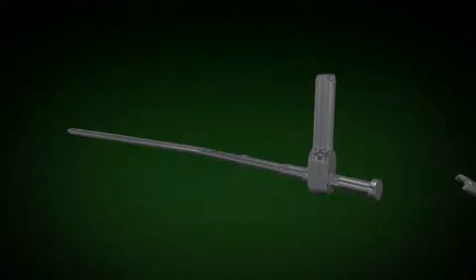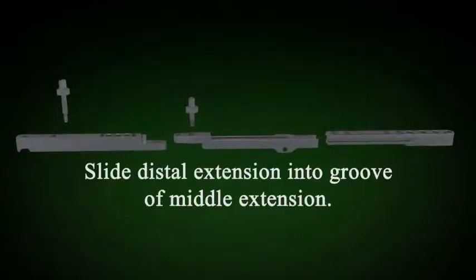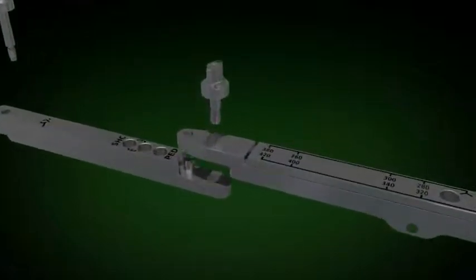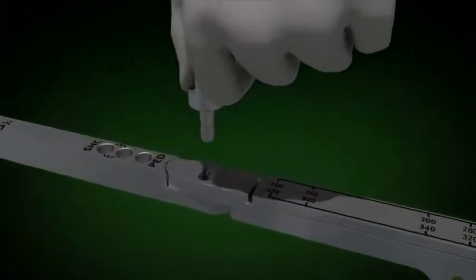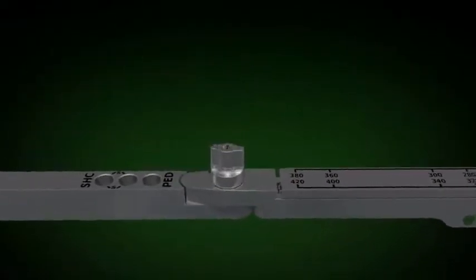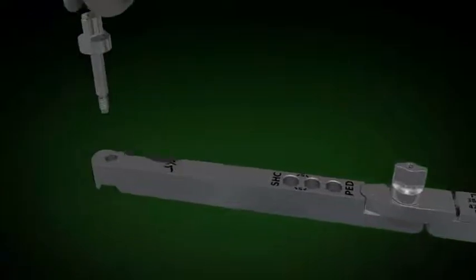We then set up the target arm so that the distal interlock can be obtained. Place the distal end into the groove of the middle extension and then attach the middle extension to the proximal extension. The proximal extension is then attached to the L handle using the shoulder bolt and tightened.